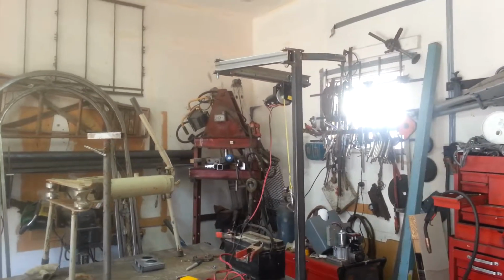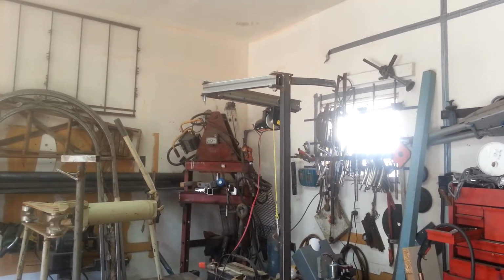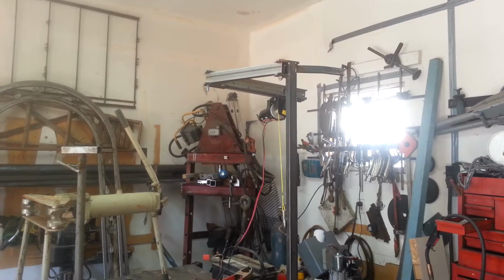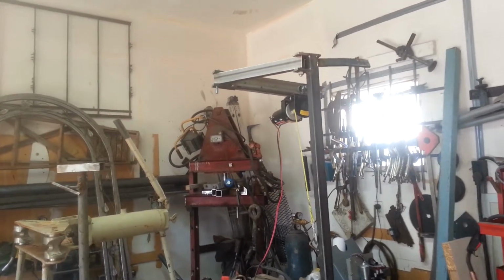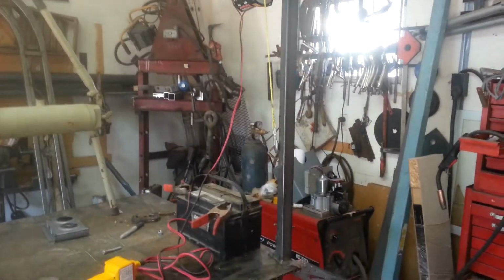Hello out there everybody. Today I'm going to show you how to build an inexpensive wheelchair lift. You can use it for some other items too, if you have trouble lifting, and put it right in your vehicle, in your van. This is made to go in a Dodge Caravan.